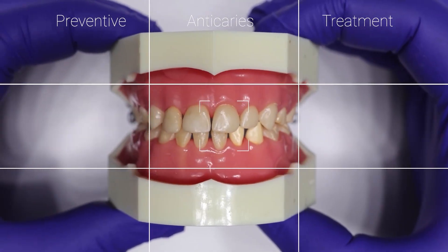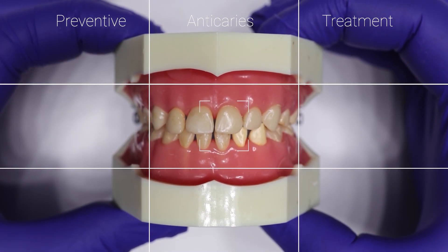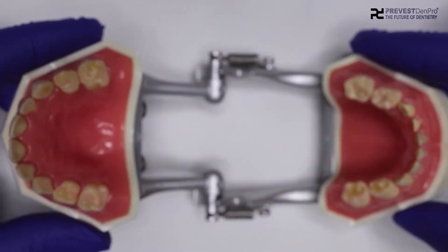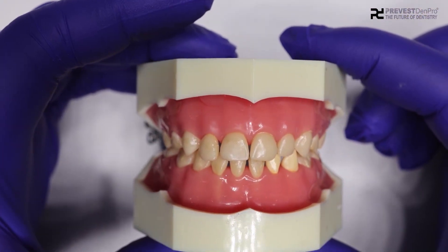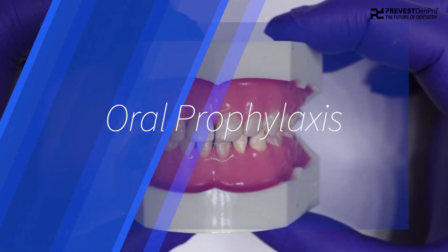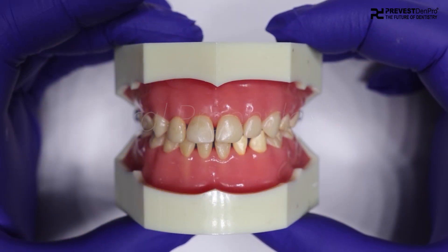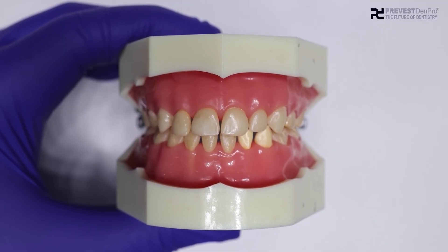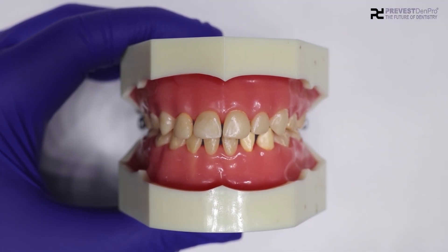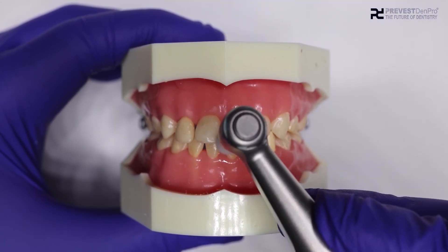Hi friends, today's video is about preventive anti-caries treatment, done with the help of Fluorotop APF, which is a topical fluoride gel. This is a demonstration video, so let's proceed step by step. The first step involves complete oral prophylaxis — removing all the debris and excess fluid from the tooth surfaces.